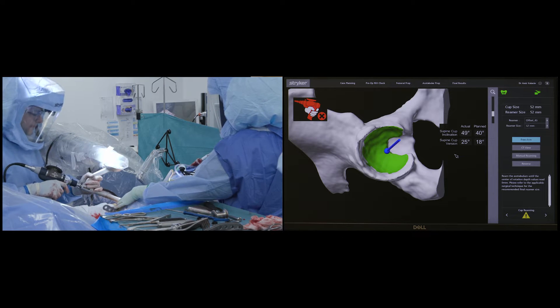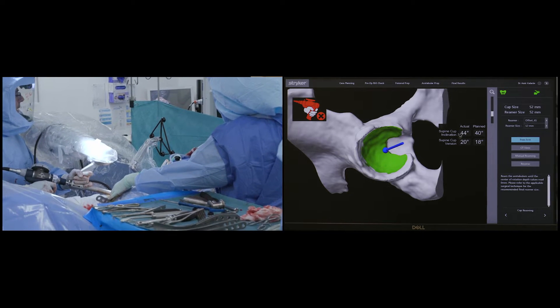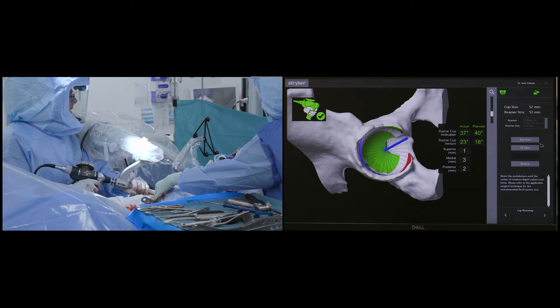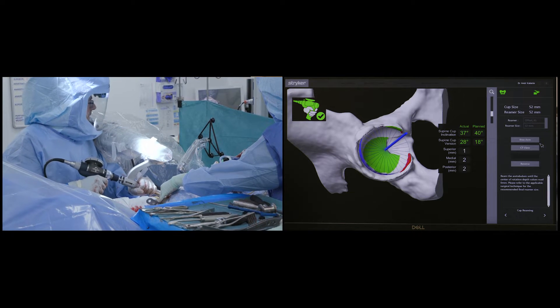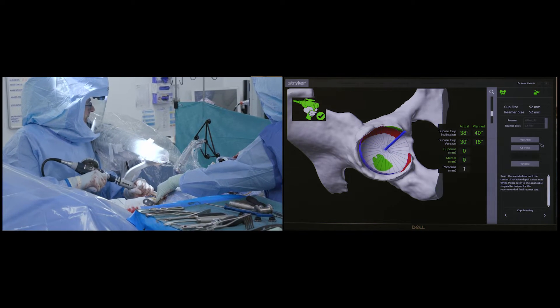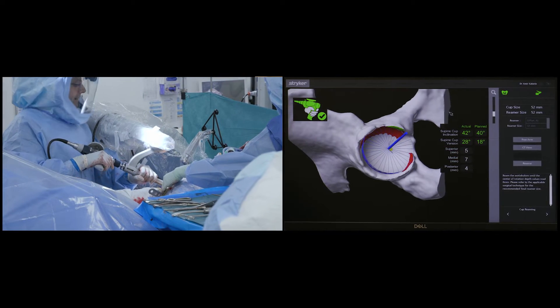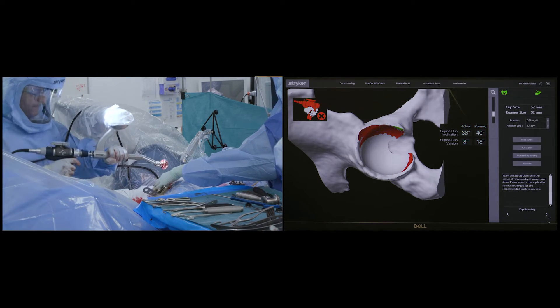Once I am happy that the reamer is fully seated, reaming begins. The bone that needs to be removed is shaded green on the screen, and I gently progress the reaming until all the green highlighted bone has been successfully excised. This method restricts the amount of bone removed to an absolute minimum, preserving the patient's own bone stock and preventing excessive medialization of the cup.